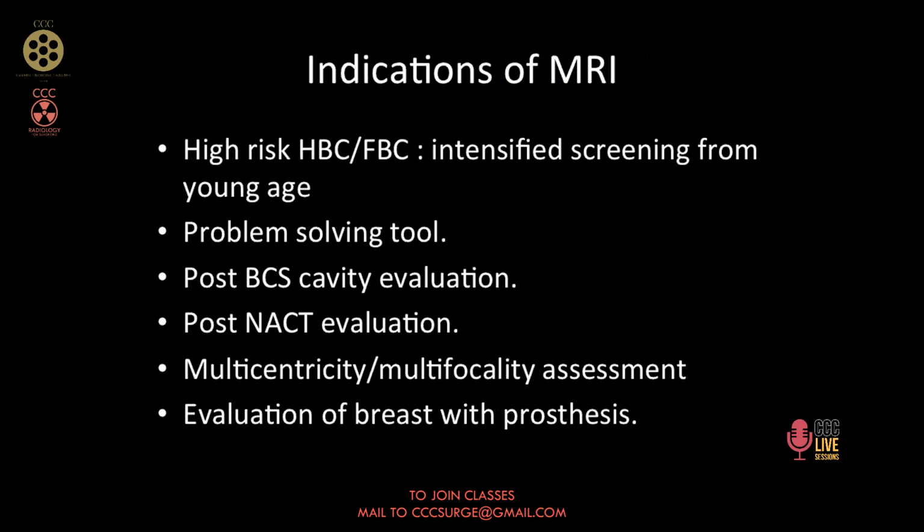If you have done a breast conservation surgery and there is something suspicious in the cavity, you can do an MRI. You have done an NACT and you want to be sure whether the lesion has resolved completely, MRI. And finally, if you have put in a prosthesis and want to know whether there is a recurrence underneath the prosthesis, it is MRI. So these are the indications of doing MRI in today's world in breast evaluation.